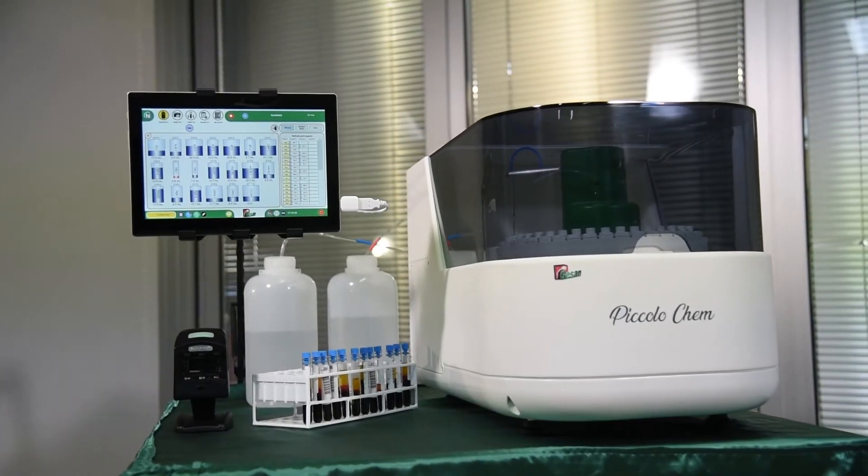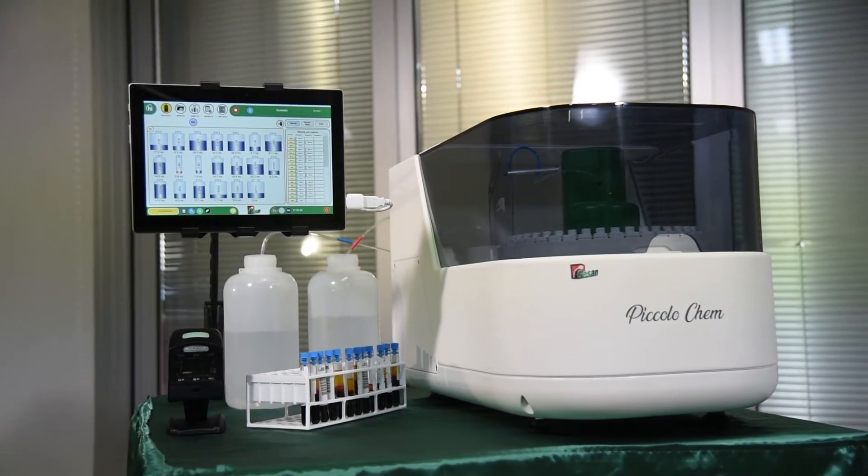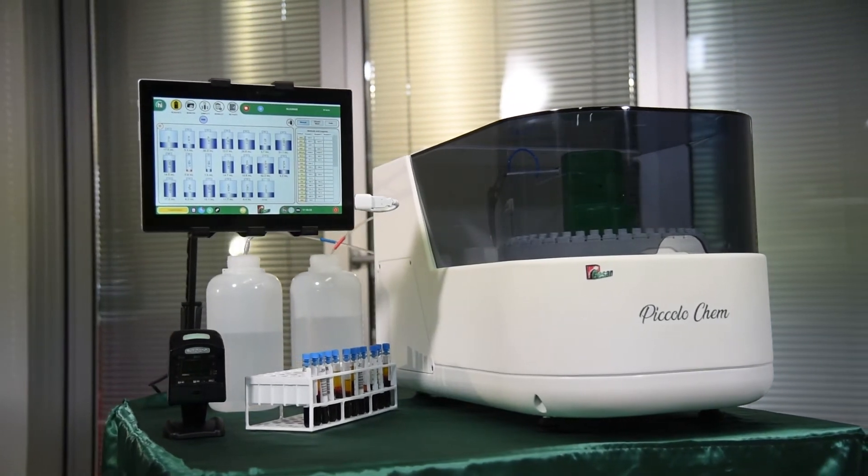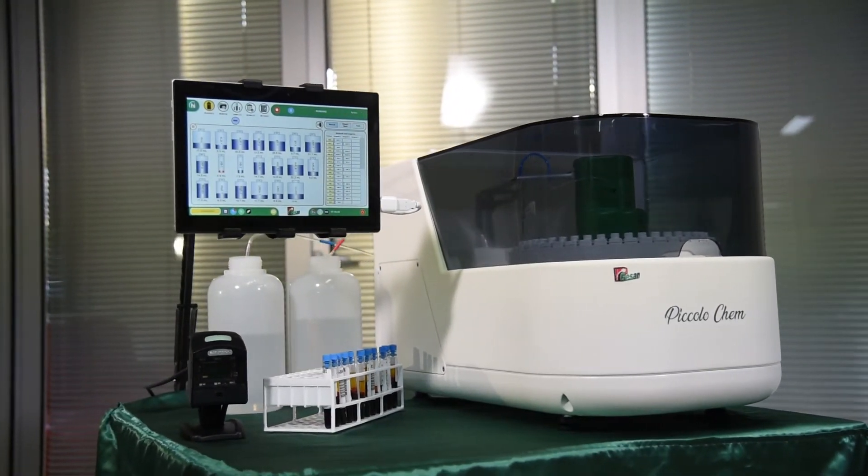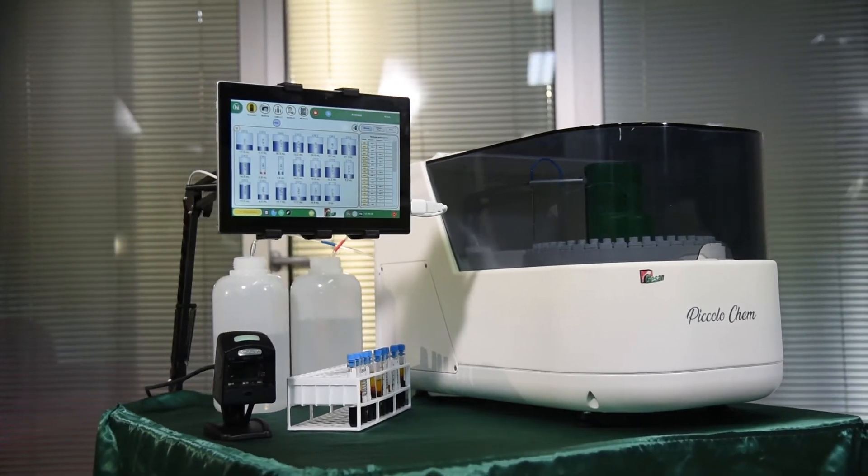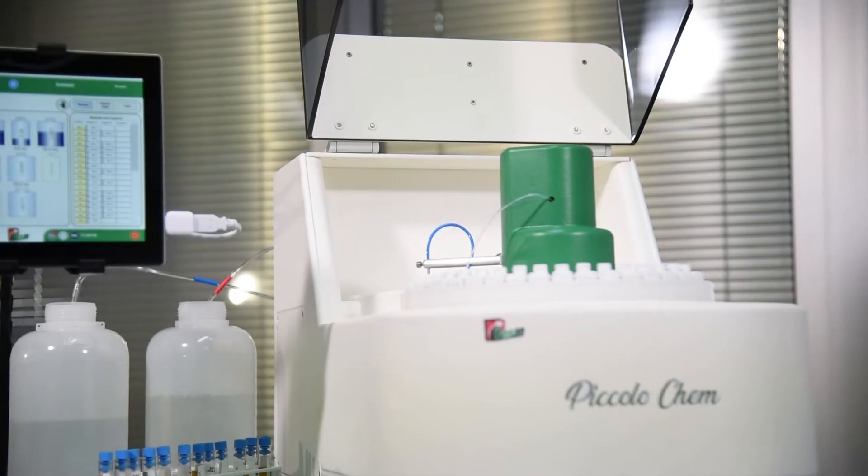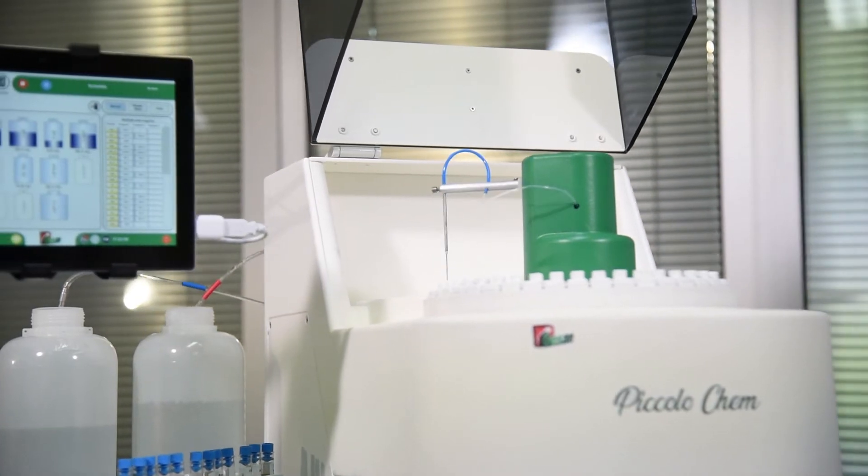Piccolo is the Italian word for small. Piccolo CHEM is small outside but not inside. It's the smallest analyzer with the greatest potential in the category.